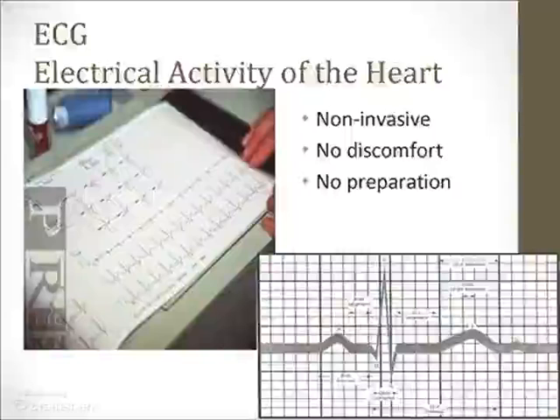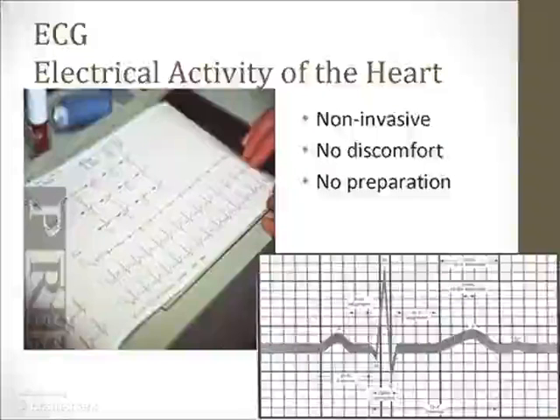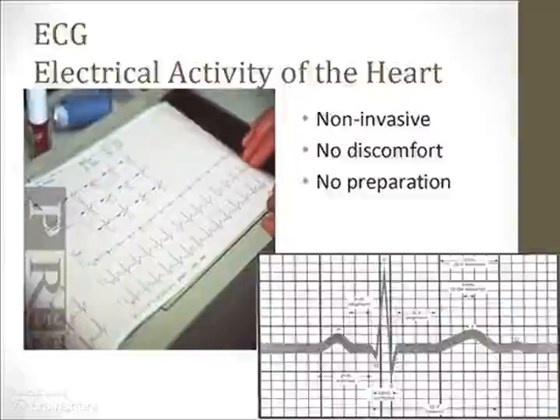The ECG or the EKG, electrocardiogram, is a display of the electrical activity of the heart. The ECG is a non-invasive study to measure the electrical current or impulses that the heart generates during a cardiac cycle. Electrical impulses travel through a conduction system, which we have discussed. It begins at the SA node, moving to the AV node via the internodal pathway. The ECG is a graphic display of this electrical activity within the heart.